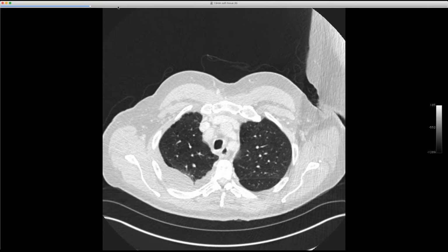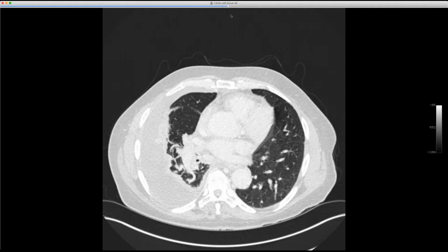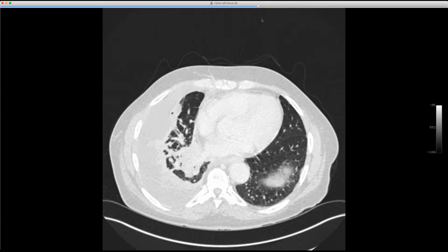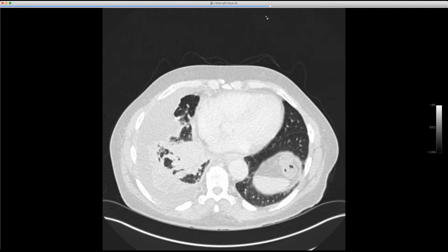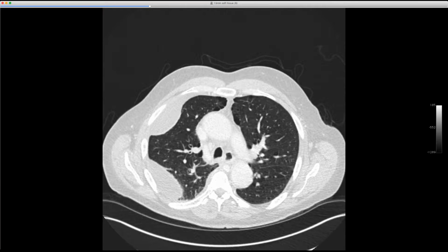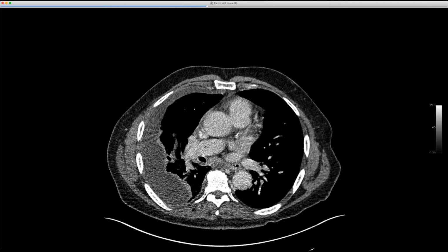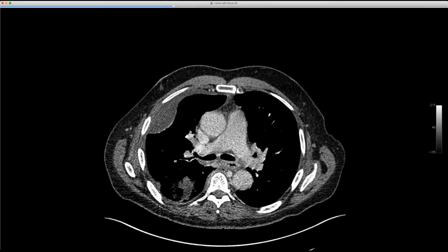Whether there was another process at some point that complicated it, I don't know, but he's responding to antifungals, though this can take a while to clear up. So I think this is probably the area of pulmonary infection, and it somehow managed to seed his pleural space. And again, with bacterial infections, you tend to see more lymphadenopathy, and he really doesn't have any. So blasto is a great mimicker. It looks like cancer. It looks like TB.